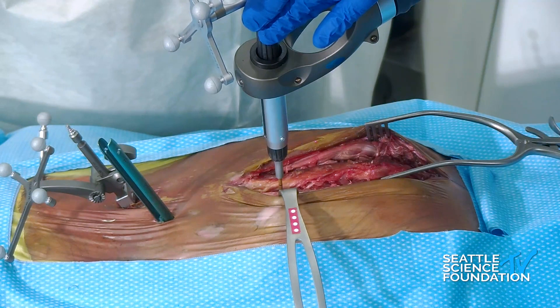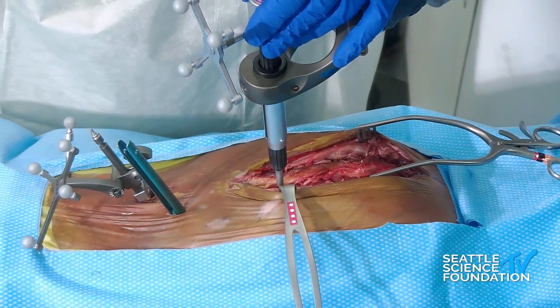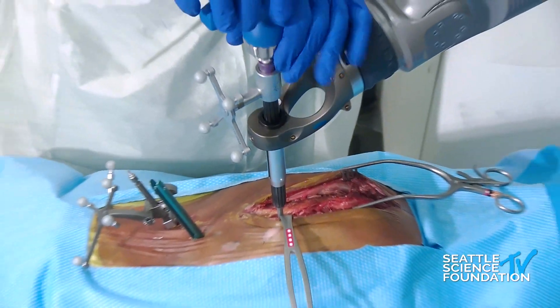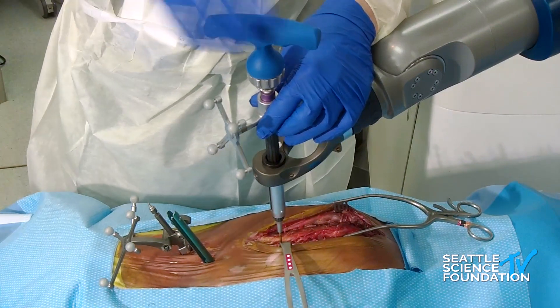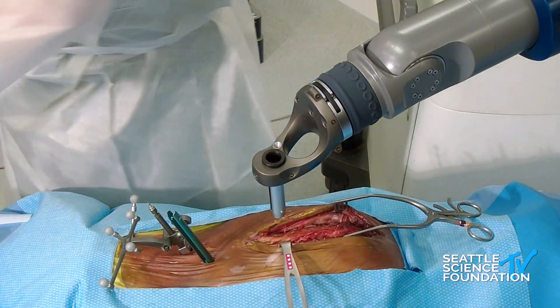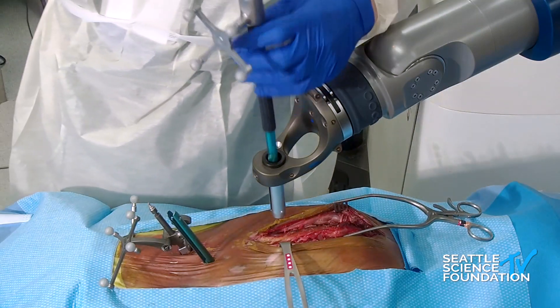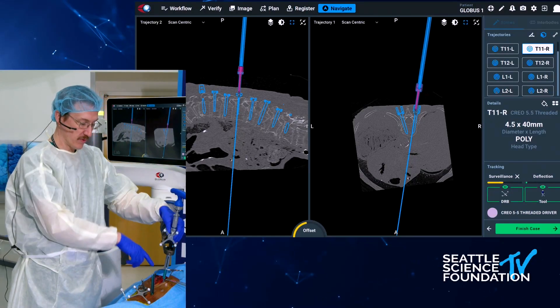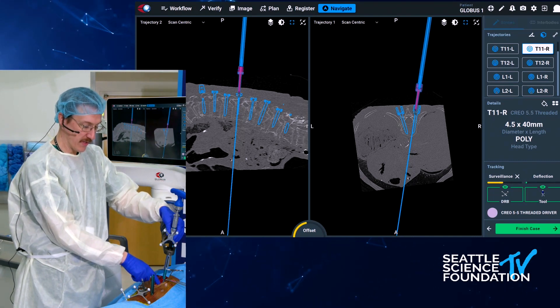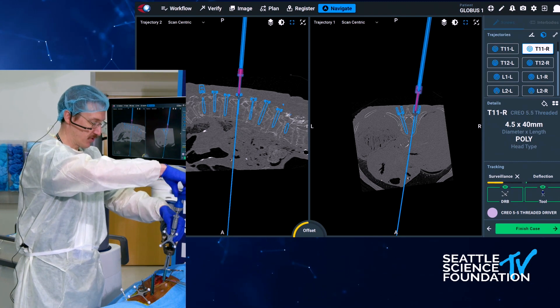I'm able to capture that through my midline incision and place the tulip heads on the screw itself. In this case, I would normally be using a headless screw because I would then move the muscle over to the side and capture it from the midline.